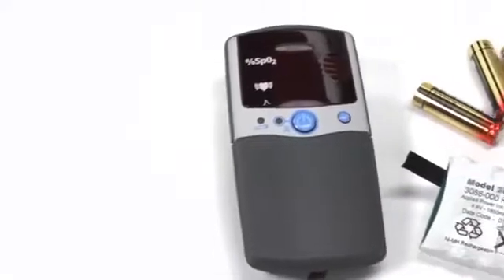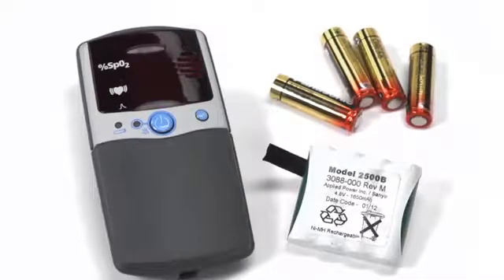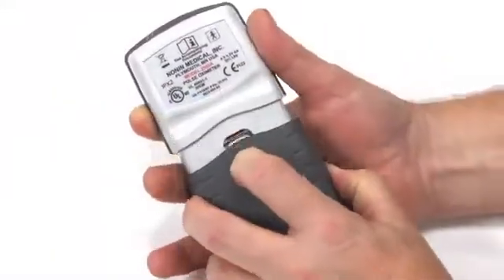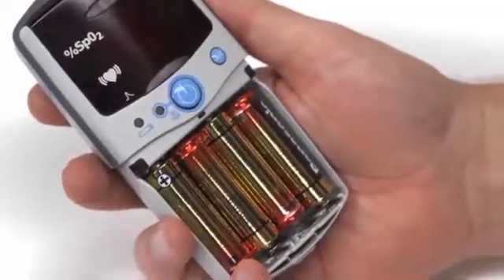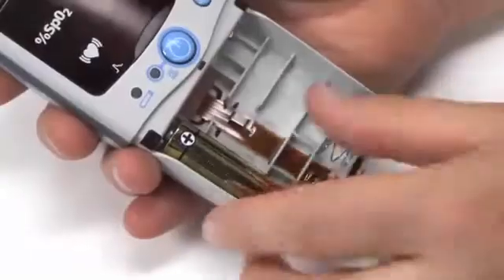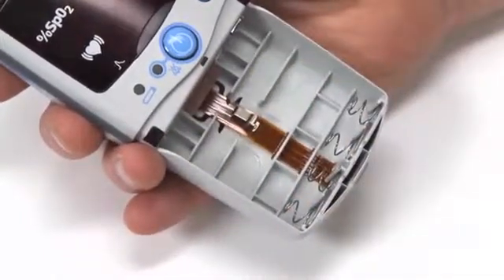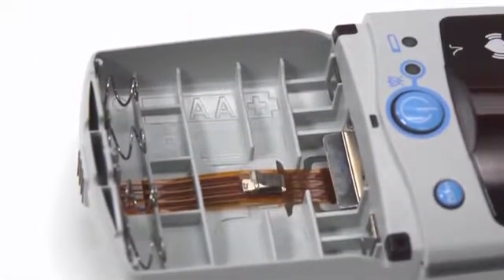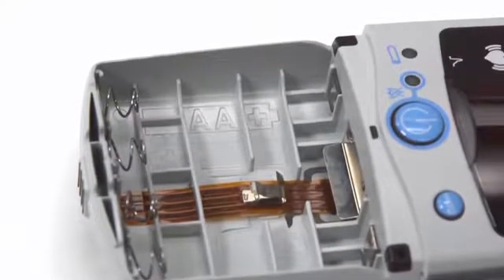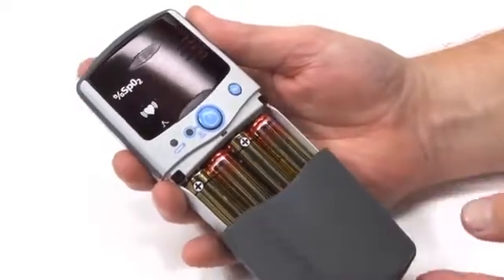The PalmSat oximeter is a good choice for both mobile and non-mobile uses. It is powered by either four alkaline AA batteries or a rechargeable battery pack available from Nonin Medical. To replace the batteries, remove the battery cover by pressing the cover latch and sliding the cover off. Remove the used batteries and insert fresh, fully charged AA batteries. Note the battery polarity position marked in the case to properly install the batteries.